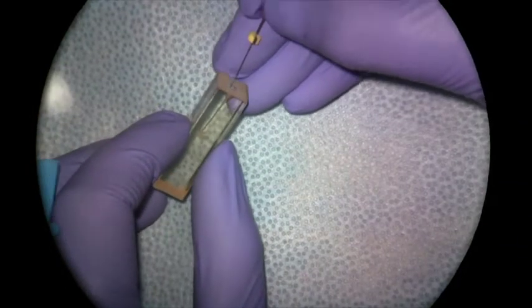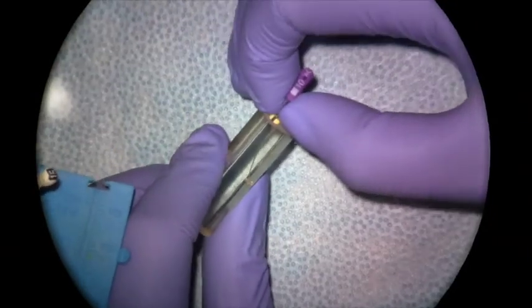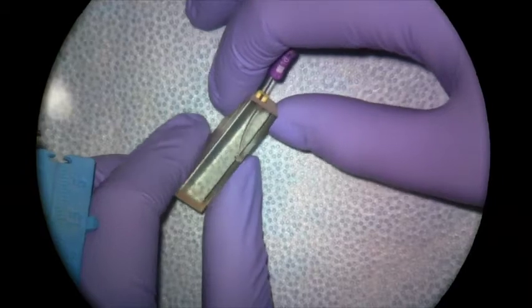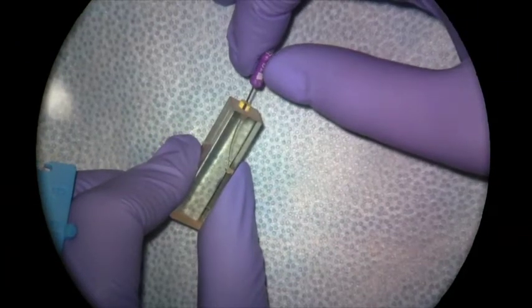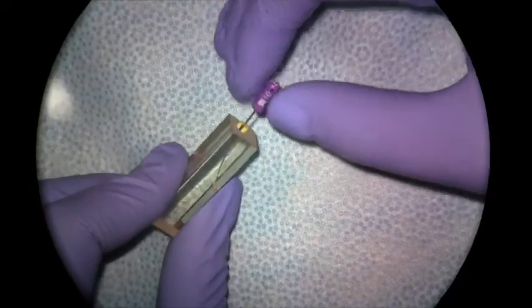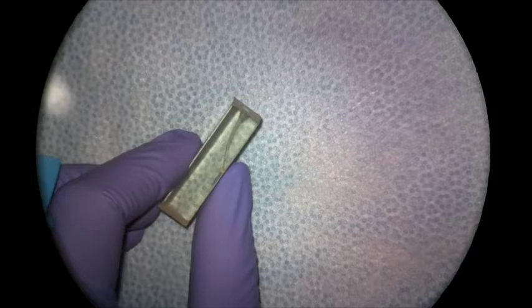Once you have your access done, you can use your images to determine an estimated working length. I've already determined this block to be 17 millimeters for my working length — both estimated and corrected because I can see it. In clinic and in pre-clinic, you would estimate from your pre-op radiographs and then take an image to confirm that length. Here I have my #10 file at my corrected working length of 17, and now I'm going to move on to creating my glide path.